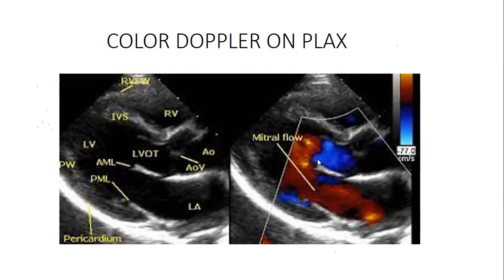Don't be surprised here if you find a mosaic color, mixed color here, because there is turbulence. Blood, the other blood is trying to come here, the other one is going this side. Physiologically, you can find mosaic color here. It looks blue, it looks also red. So red coming here, and as it comes here again, it changes the color.